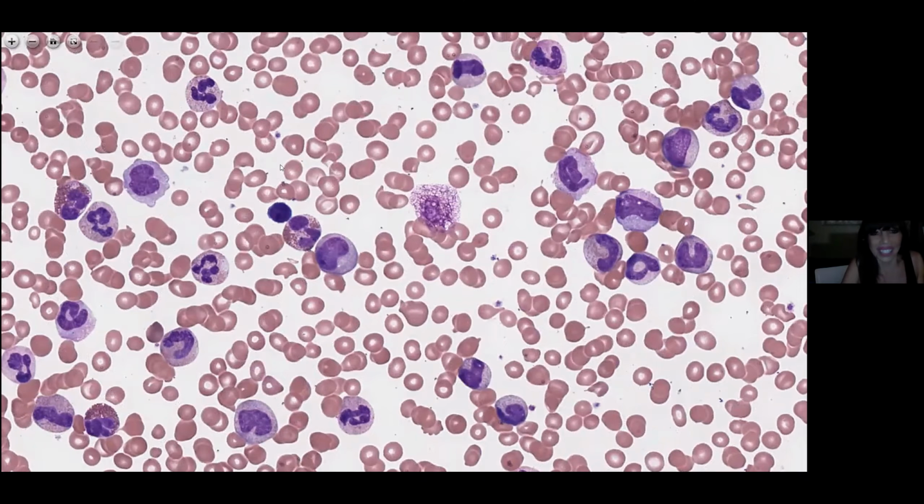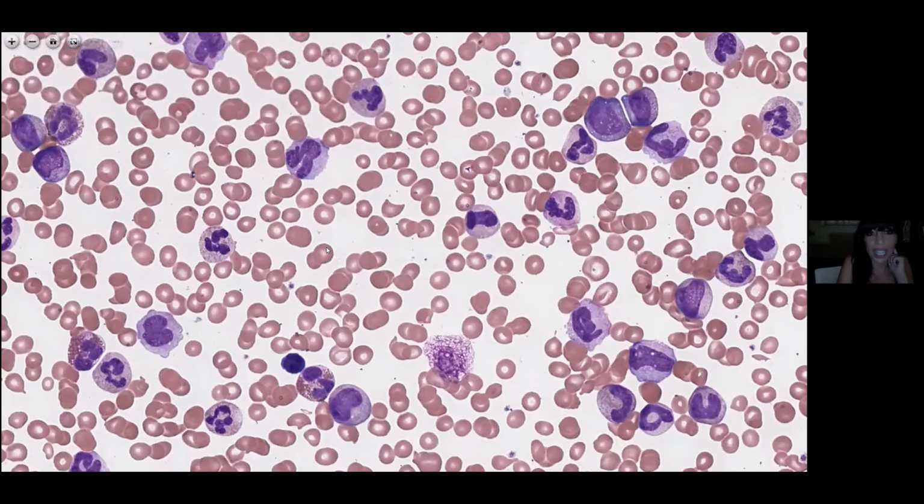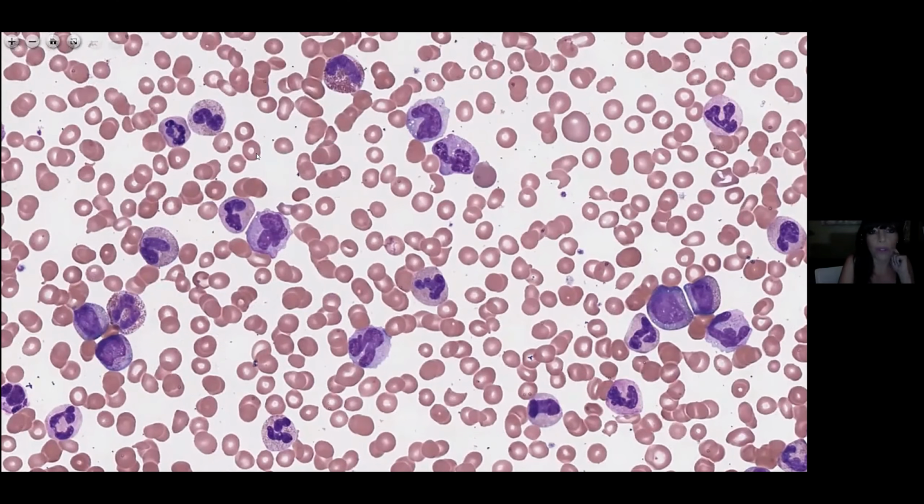Yeah, that's okay. It's funny that you mentioned the basophil count, because it actually happened at a facility I was working at, in a case that was CML, where the techs were so overwhelmed with all the segs and the immature cells, and I think the count was 400. So even at 100, the fields were just filled, and they would skip all the basophils. So they weren't reporting the basophils at all, even though they're around 3 or 4%.